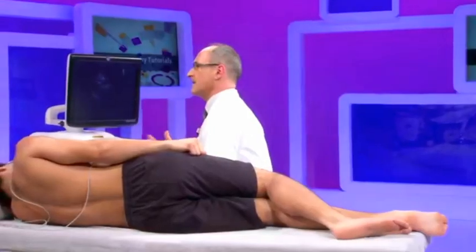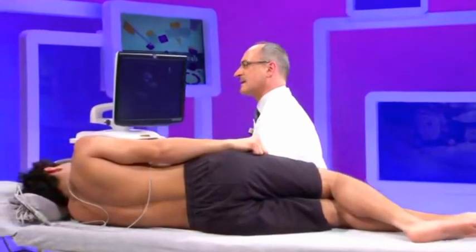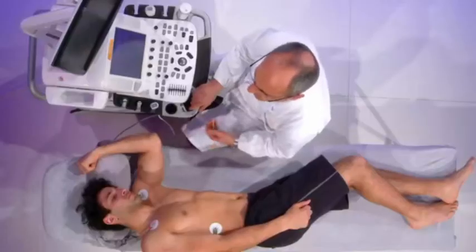So the point is that every measure, every image that you can acquire during the present study should be compared with the previous one to be able to say, okay, this heart transplant patient is going well or is going to have a suspicion of a complication such as acute rejection or CAV. Then when you have become confident with the previous physiology of the transplant heart in this patient, you can start your examination.